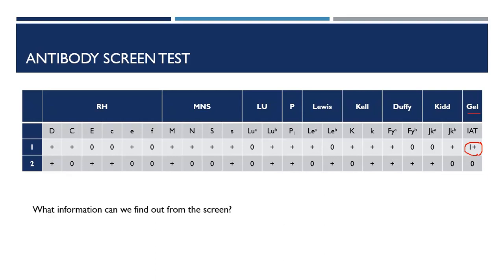It's something that we do need to identify so that we can help provide blood that's negative for the corresponding antigen. Although there is no autocontrol that's been performed, we do see that we have a negative reaction here. And also the ABO typing that we did previously, if you remember, I pointed out that we had a negative reaction in the forward type and we had a negative reaction in the back type. So the likelihood of us having a cold antibody that would be interfering with the testing is unlikely.